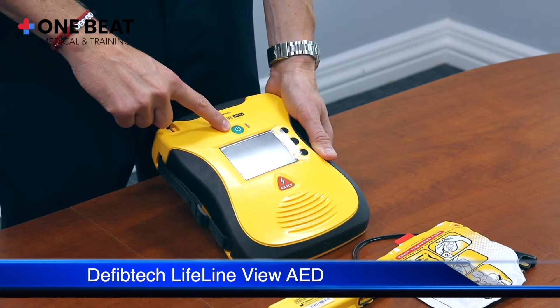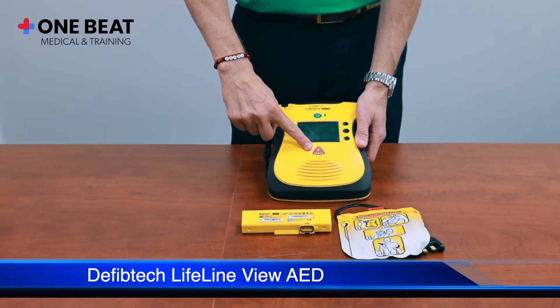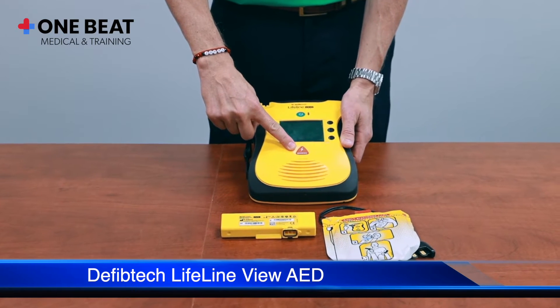You have your green on-off button, and you also have your shock button, which will need to be pressed if the device determines a shock is needed.